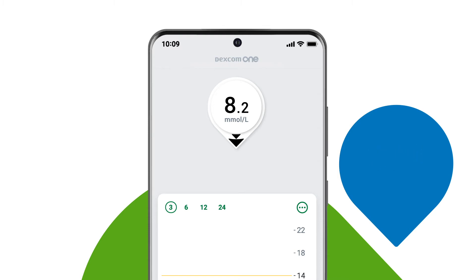The arrow helps you keep constant track of your levels, enabling you to take action before your levels are too low or too high.